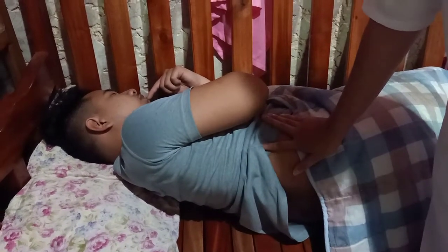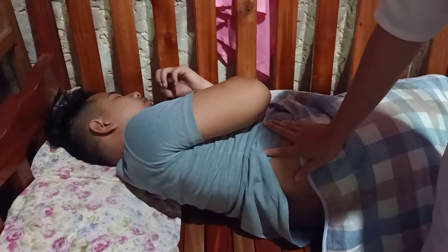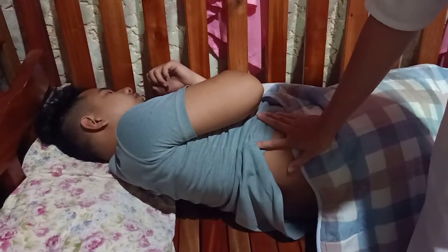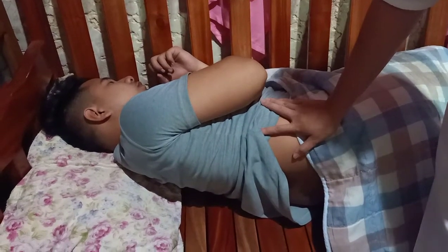Extend the middle finger back along the iliac crest toward the buttocks. The index finger, middle finger, and iliac crest form a V shape. The injection site is the center of the triangle.